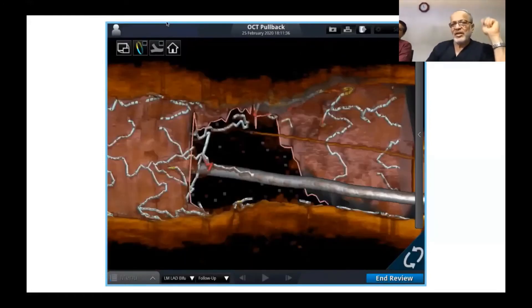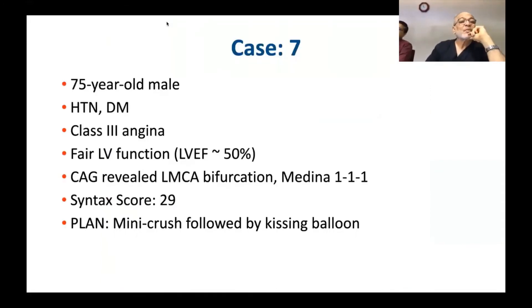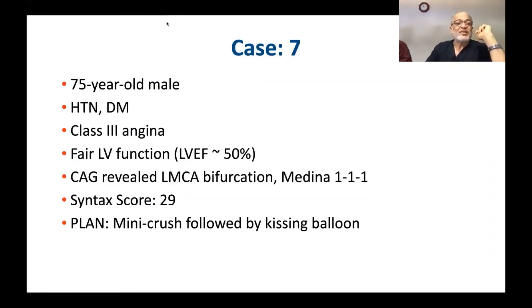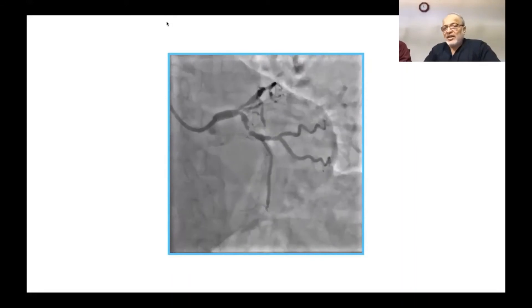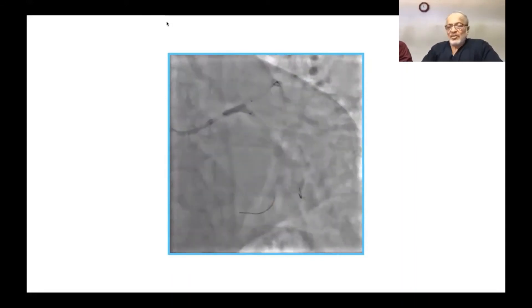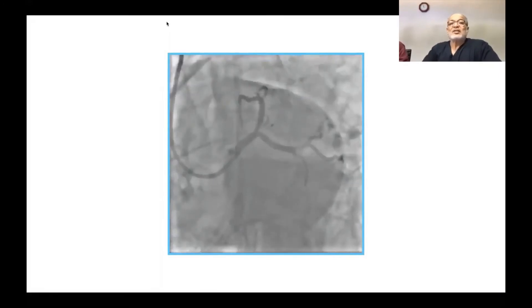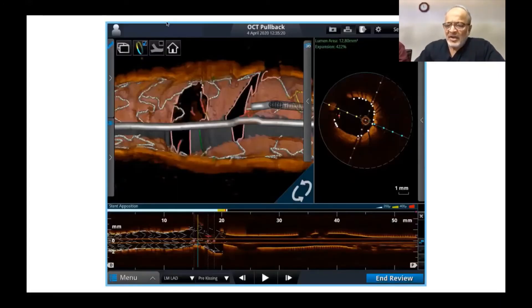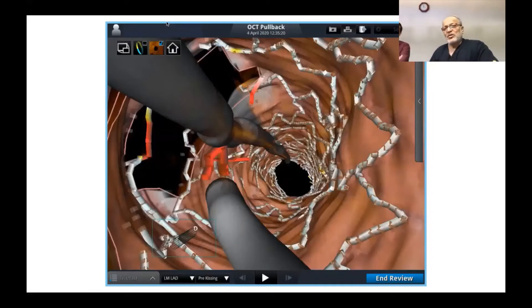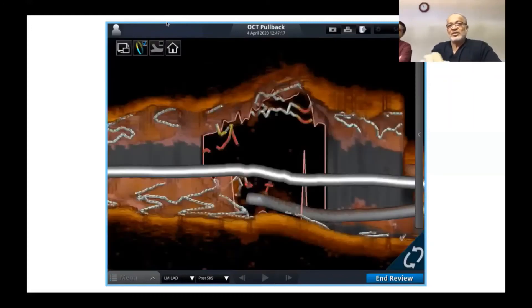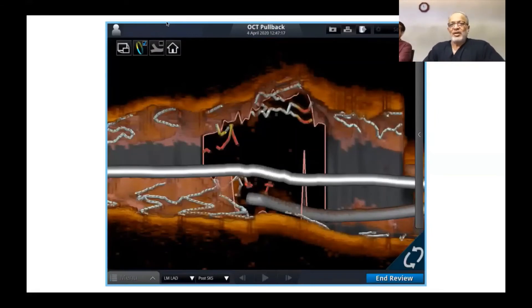A 75-year-old male, hypertensive, diabetic, class 3 angina, fair LV function, LMCA bifurcation Medina 111, syntax score 29 — a very complex left main. Mini crush followed by kissing balloon was performed. Result looked reasonably good with some underexpansion of the proximal LAD segment, but on OCT it was not all that bad. It was a proximal crossing — in the fly-through view some struts were hanging at the circumflex origin region, and the reconstruction image showed some struts but still a good lumen. Result was acceptable and patient is doing well clinically.